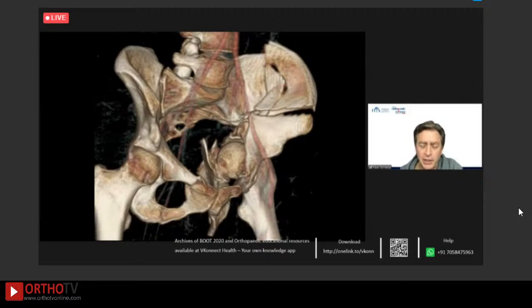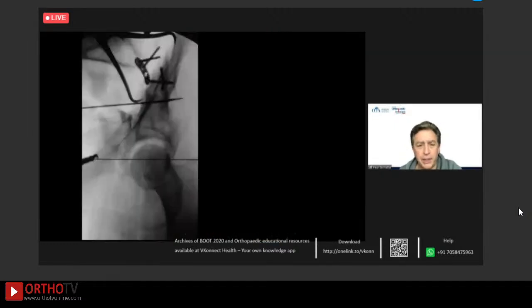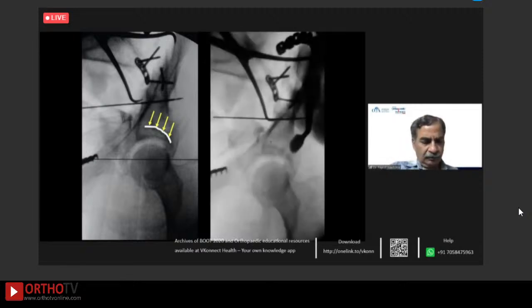And surprisingly, there was not a lot of damage on the head. I was shocked to see that the head didn't look terrible. I'm sure there is some cell death, but I did as you said, Dr. Malhotra. I went to the back, and I always start at the iliac crest. Also, that was the only thing I had any confidence that I could reduce, so I felt pretty good about that. And you can see that separate roof fragment still, even on these views. So we went to the crest, and then sort of built back.